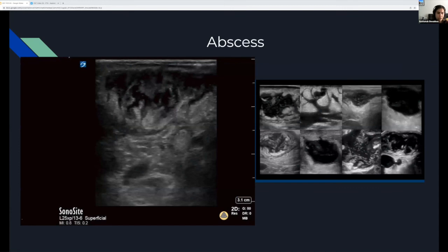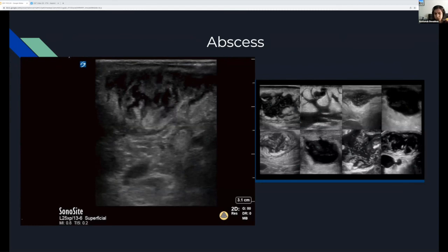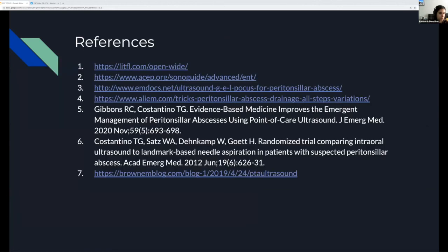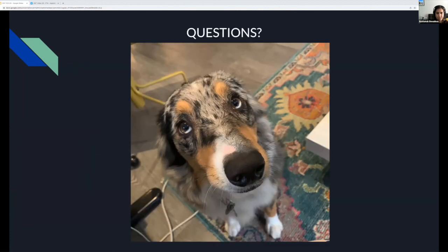The other thing is neck abscesses — I'm not going to go too much into that since we've all scanned abscesses a lot. It has an irregular border, can have posterior acoustic enhancement — that whiteness behind the abscess due to the fluid inside — and if you move your probe around you can actually see the pus moving. You add that to the clinical picture, and if you see fluid that can be drained or aspirated, you do that. That's it for me. These are my references — happy to send out those two papers as well. Any questions or comments?